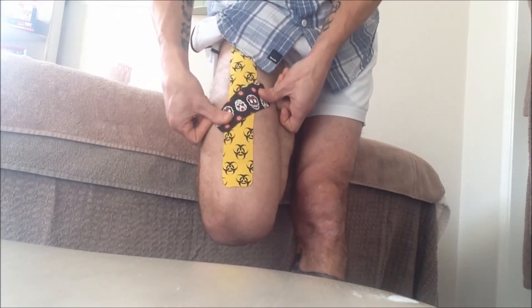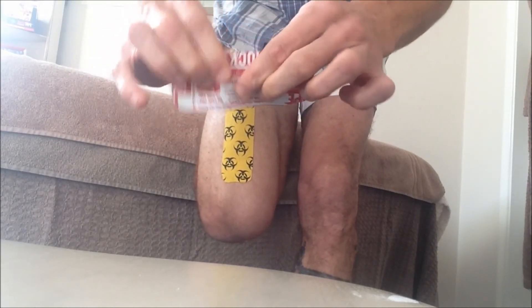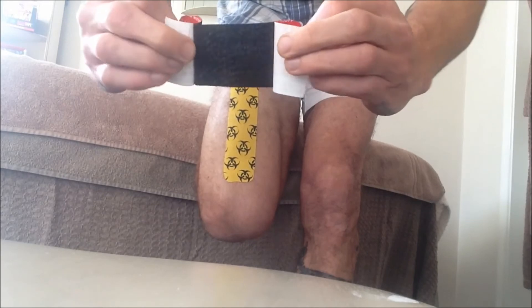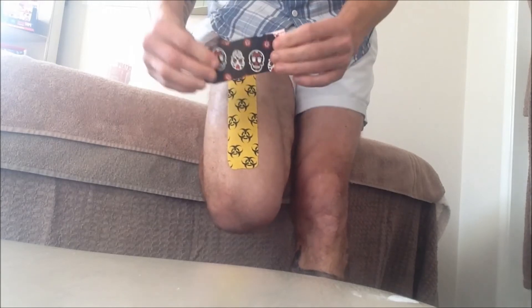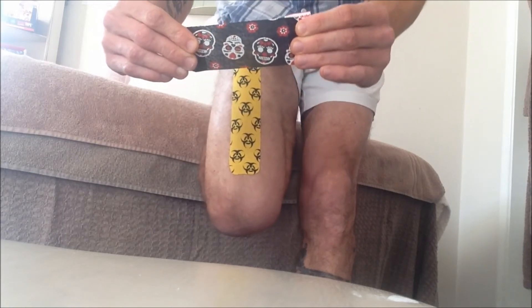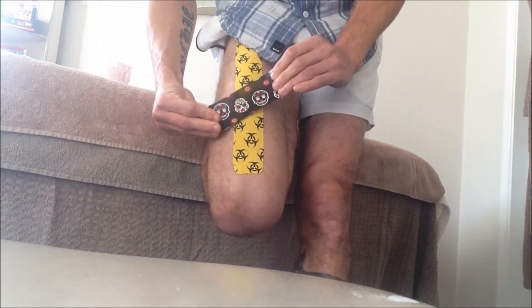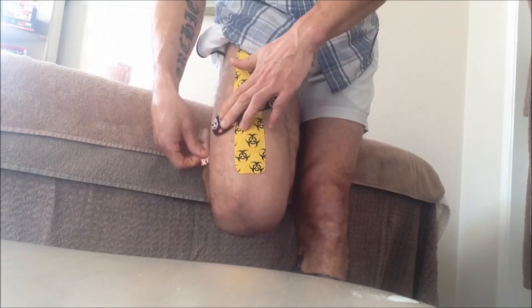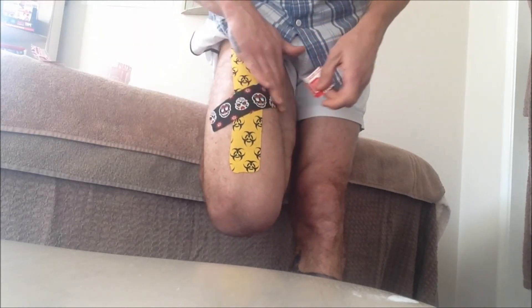Now, if the pain we're experiencing is in a specific area, we want these two strips to cross directly over that pain. The way we lay these is to break them straight down the middle — the tape is in half — give it a tug and the tape will lift. Grasp it and pull back so we're holding the tape. Then go to the area of pain: this is no stretch, this is 100%, this is 50% — we want to go for 75% to 100% stretch and lay that directly over the pain. Then smooth off the ends with no stretch at all.